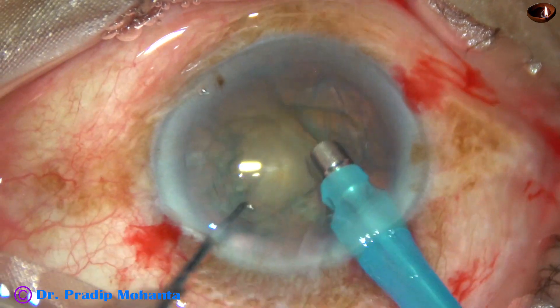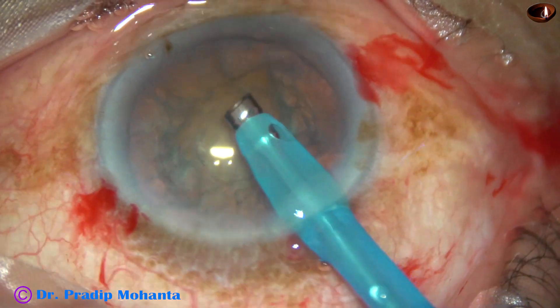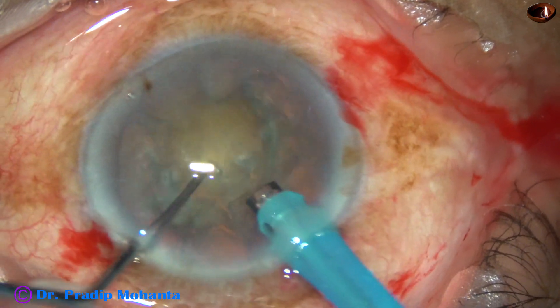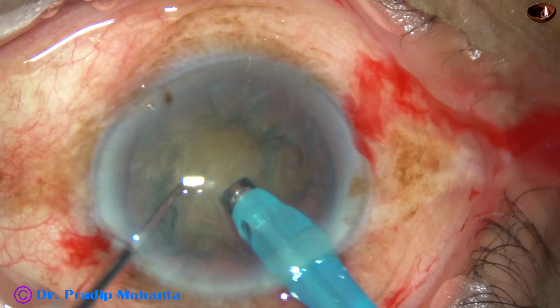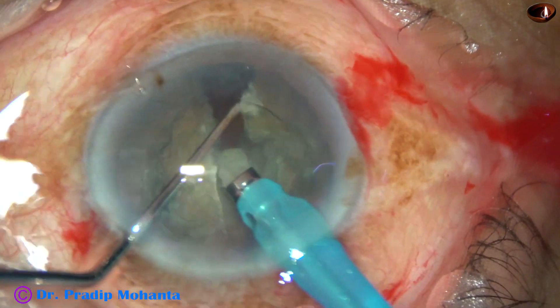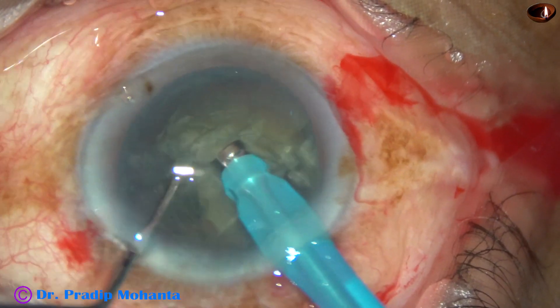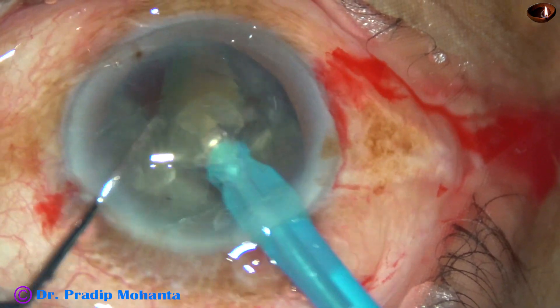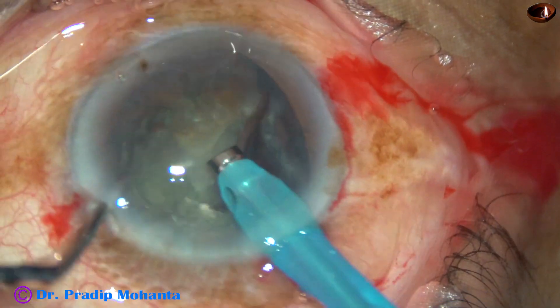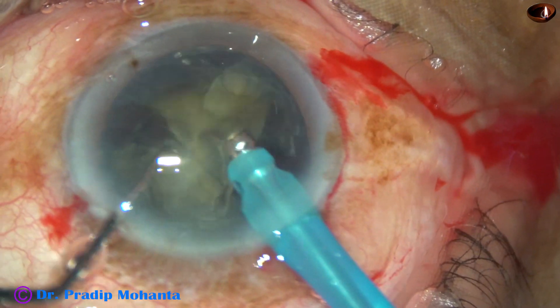After removing some superficial cortical lens matter, the handpiece is turned, the bevel is made up towards the cornea, and then the tip is buried into the substance of the nucleus and the nucleus is chopped. In grade 3, grade 3 plus or grade 2 plus nuclear sclerosis, chopping is just a piece of cake — it's very easy. The cataract is usually brittle in these cases.